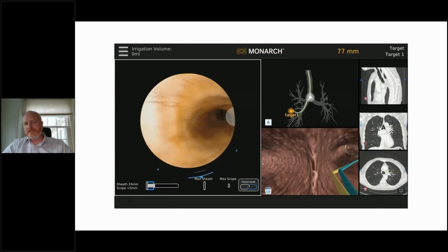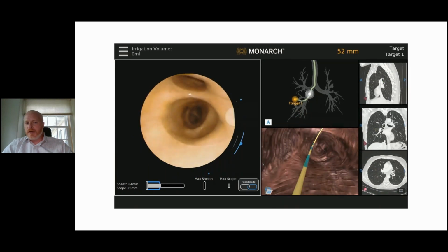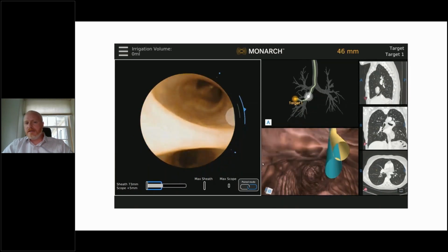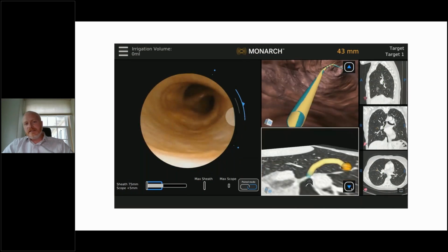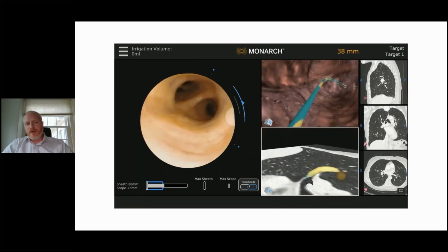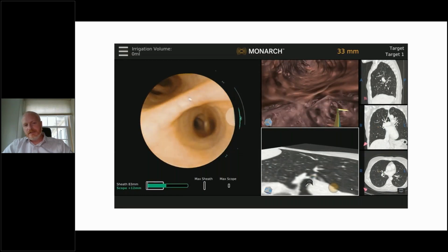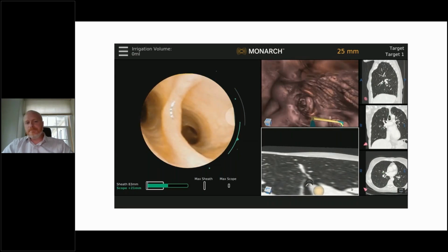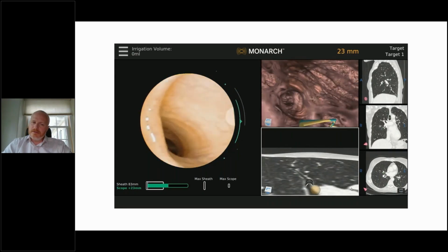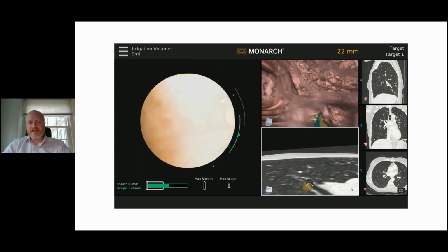After we do our registration, you can see I'm driving with my external sheath, approach the right middle lobe of the lung, and then switch over to drive the internal camera. You see there's the medial and lateral branches of the right middle lobe, and I'll actually flex into the lateral branch. And then in the sub-segments, I'll overflex so I can pop into that sub-segment and then correct to get back centralized within the airways.